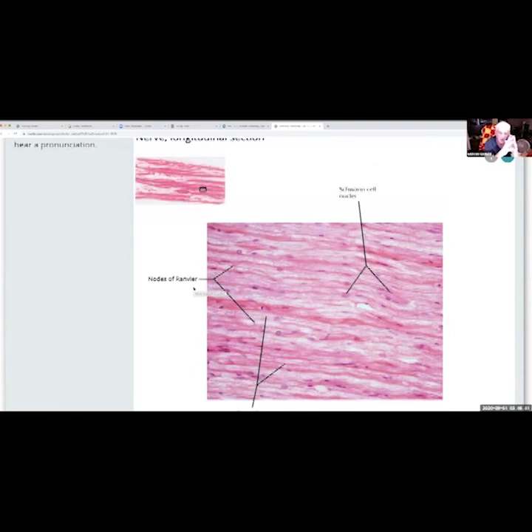We used to think nerves could not be repaired at all. Nerves cannot regenerate ever. If you lose a nerve, you've lost it for life. If you damage a nerve, you can actually get some repair now. This is called Schwann cells. Schwann cells initiate a type of bridge that allows the nerves to actually communicate from one side to the other.